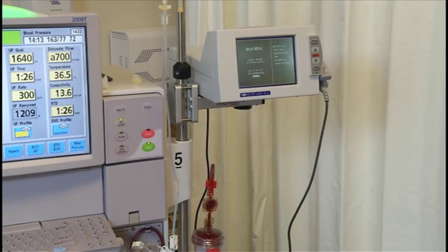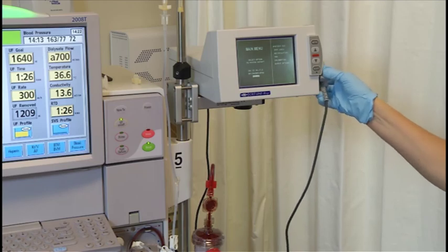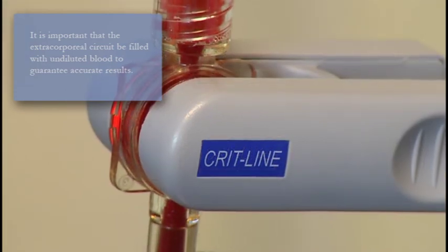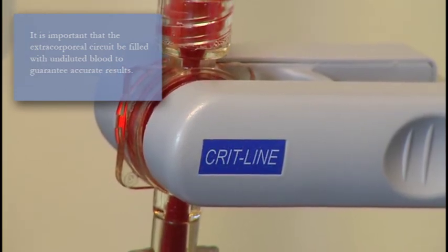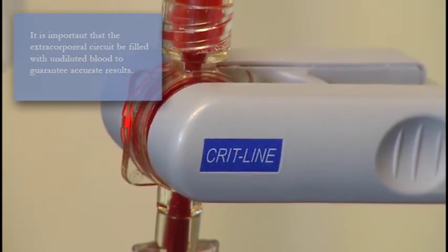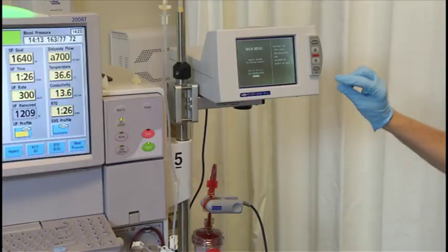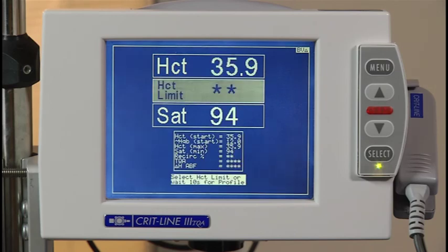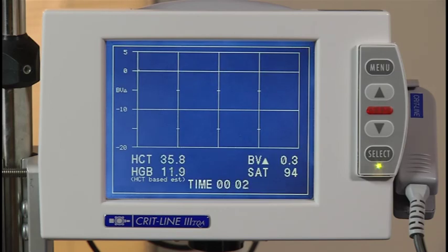Three to five minutes after starting the dialysis treatment, and when no air or saline is present, place the sensor clip so that it is perpendicular to the blood chamber. The sensor clip will glow red when the monitor is turned on. Choose start run and press the select button. The CRITLINE monitor will display the startup screen, and it will take approximately one minute before any readings are displayed. Once values appear in the hematocrit and sat fields, the screen will change to the blood volume monitoring profile after approximately 10 seconds.